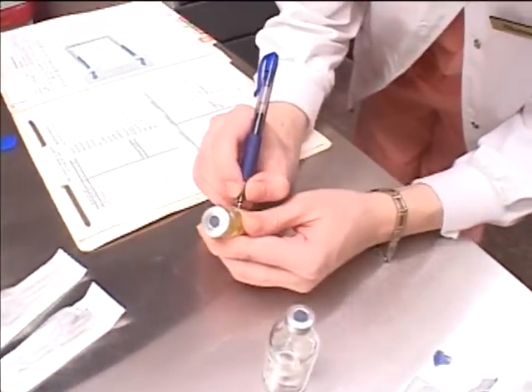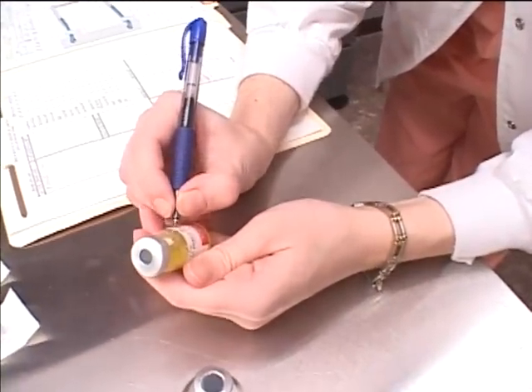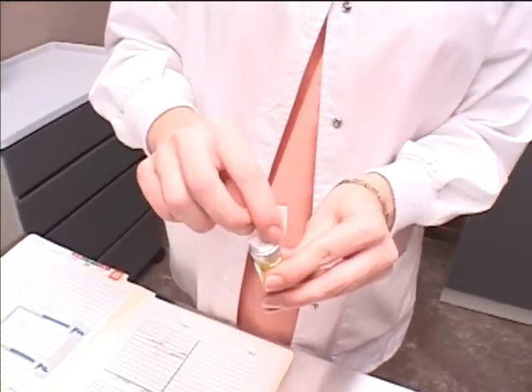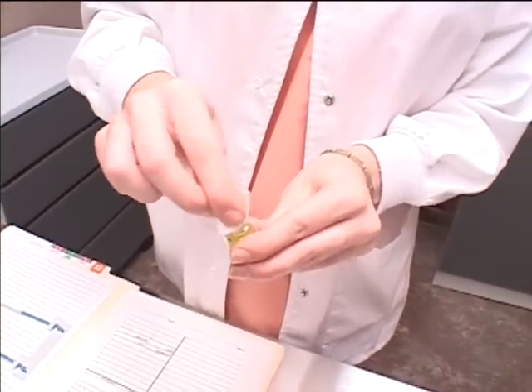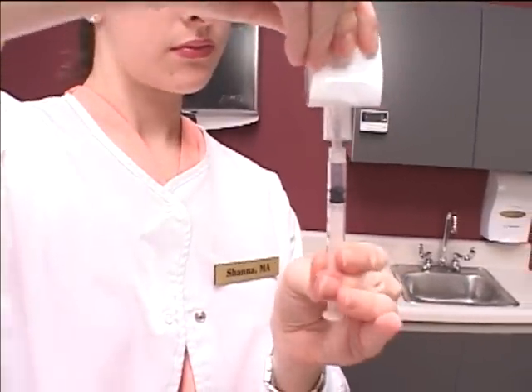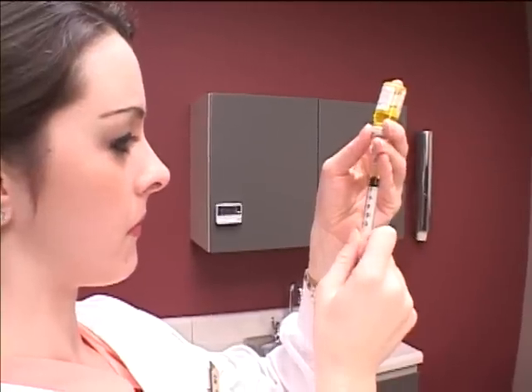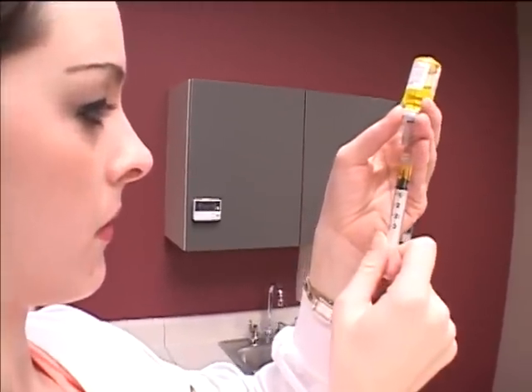Label the vial dilution of the medication with the date, time, your initials, and the expiration date. Clean the mixed vial with an alcohol swab. Assemble the syringe and needle according to institutional policy. Withdraw the desired amount of medication using the technique demonstrated previously.